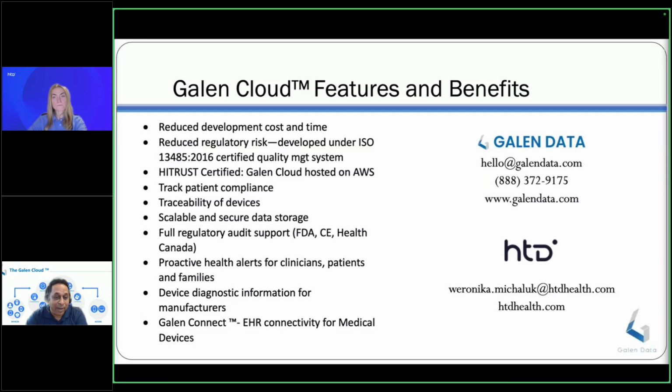But if you're going to add a new feature that changes how the patient interacts, that typically is going to be harder to put in a PCCP. Again, I'm not a regulatory expert, and this is a very new guidance, so we really don't know how the FDA is thinking about it. Plus, you don't have an equivalent in the EU yet of something like this.